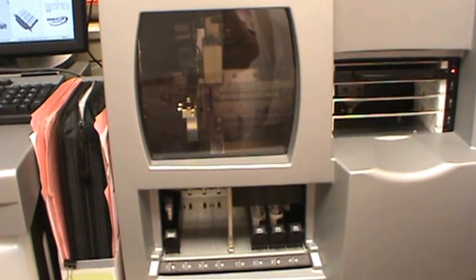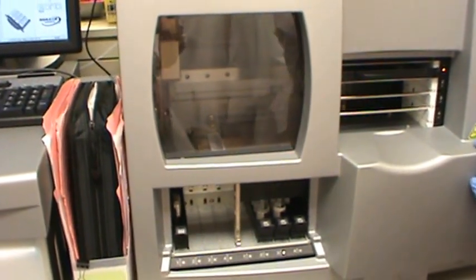And he's going to make his 3 to 5% suspension. He's very efficient. And he drops his drop, and gets rid of the rest.